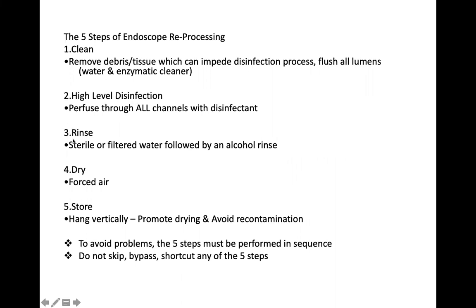Then you rinse it using sterile or filtered water followed by an alcohol rinse. Then you dry it using forced air. And you store it vertically in a safe place, free from dust, moisture, etc., until you can use it, then you go through this process again. This is one example of reprocessing of a medical item.